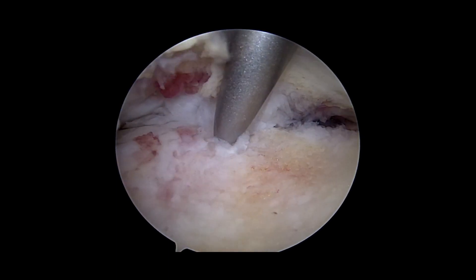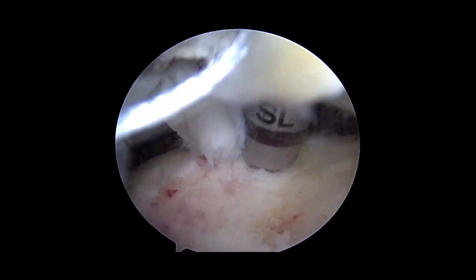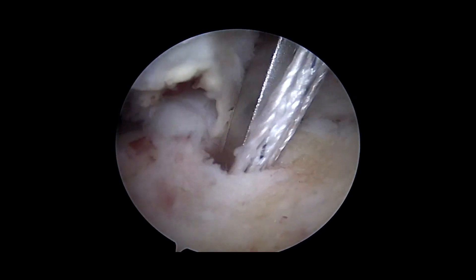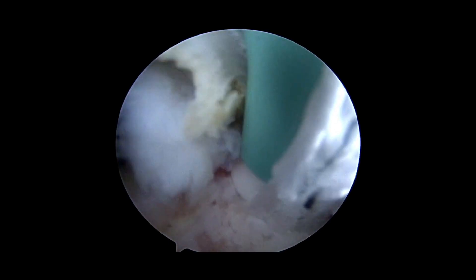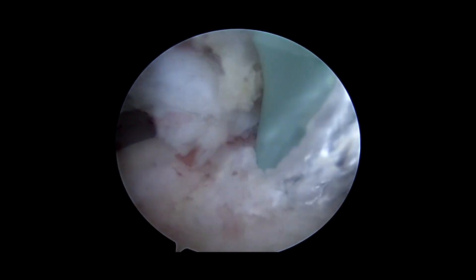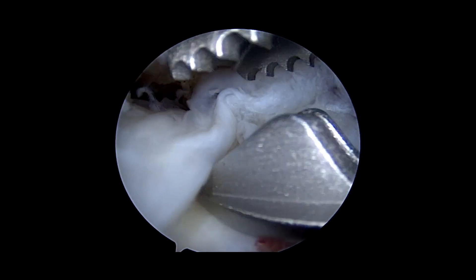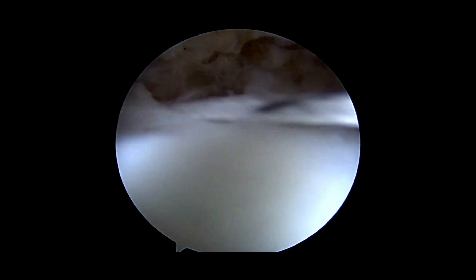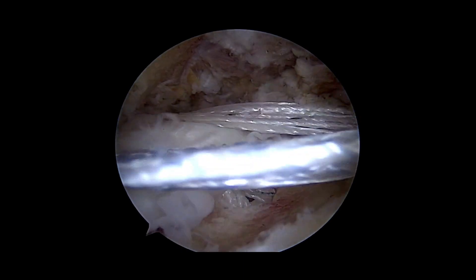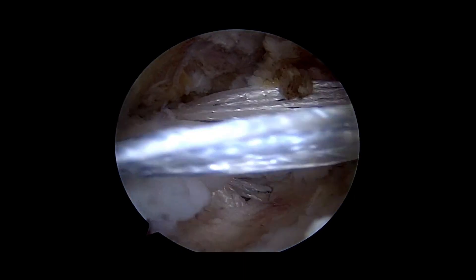We're now placing the anterior anchor at the anterior edge of the tear. This is a white tape, which is going to be screwed in. The tapes are again loaded into the scorpion. Both laminae are picked up and the scorpion deployed. The tapes pull through, and when we pull on both tapes, we get a nice reduction of the tendon over the footprint.